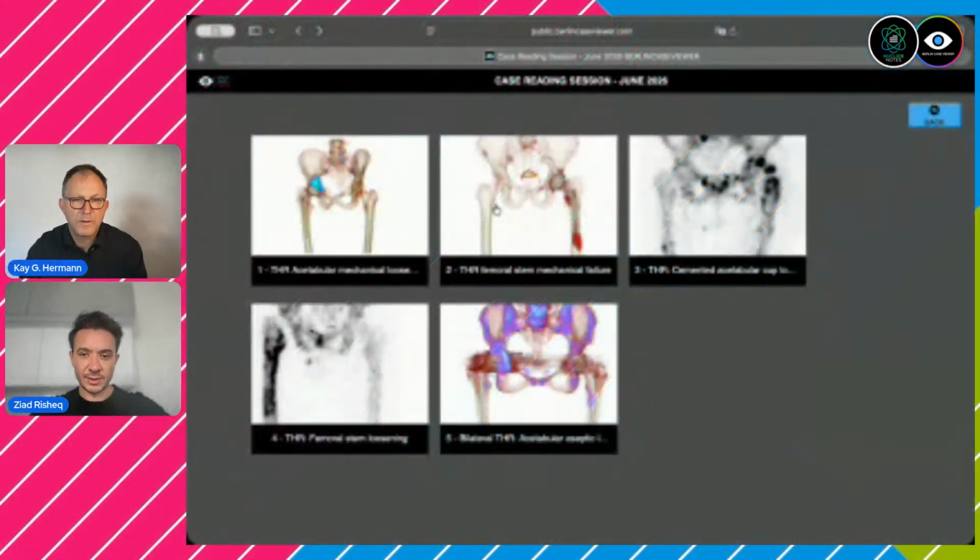But if you're using a technetium tracer, you can do it the next day or within the next 2 days. The half-life is 6 hours, so you don't expect to see much tracer uptake after 24 hours or after 48 hours. Okay.